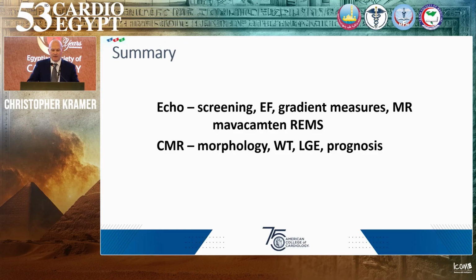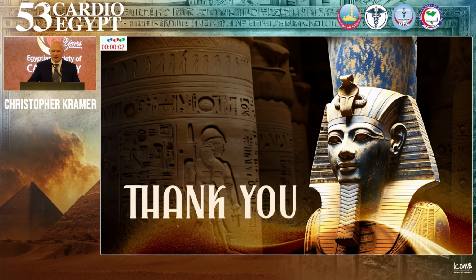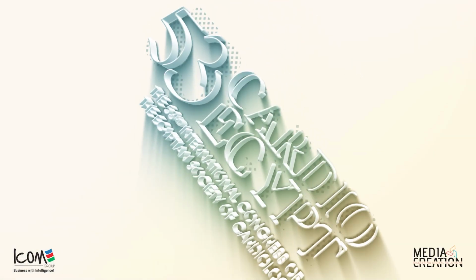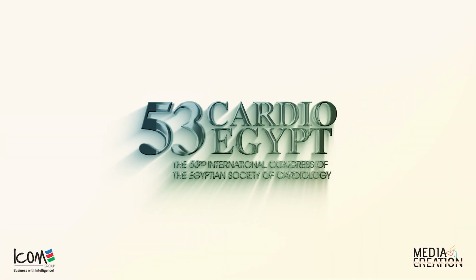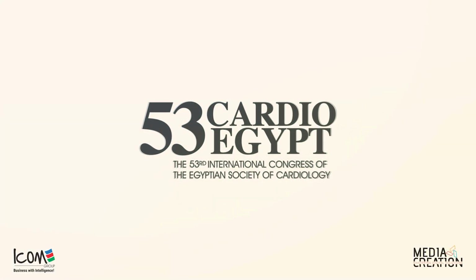So in summary, echo is quite useful in HCM for identifying patients, measuring the gradient, measuring MR, and following patients on CMIs, but CMR is crucial for identifying morphology, wall thickness, as well as scar for identifying prognosis in HCM. And with that, I'll end, and thank you for your attention. Thank you.